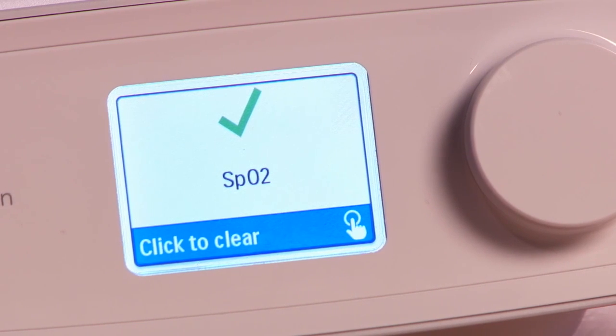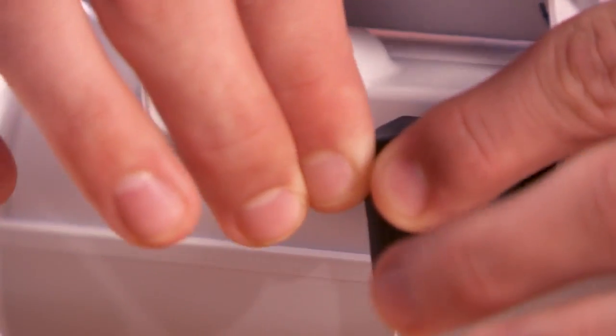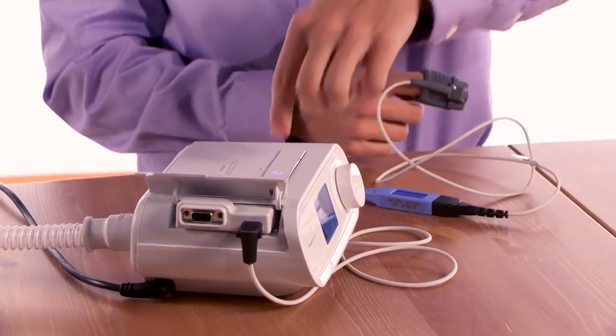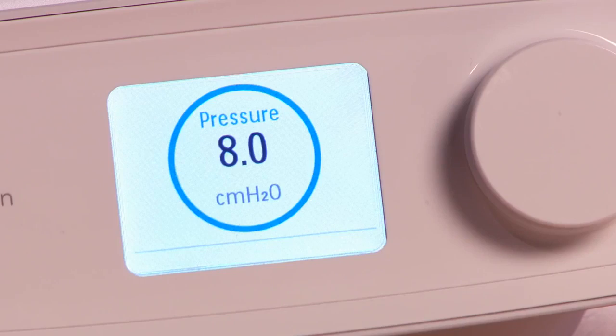If you do not get this icon, turn off the blower and check that the components are fully connected. Then reapply the oximetry sensor to your finger. Turn on the therapy device and check for the good connection icon again.